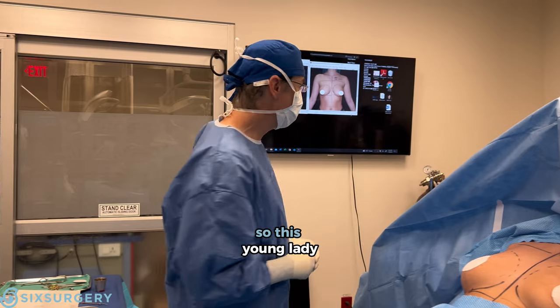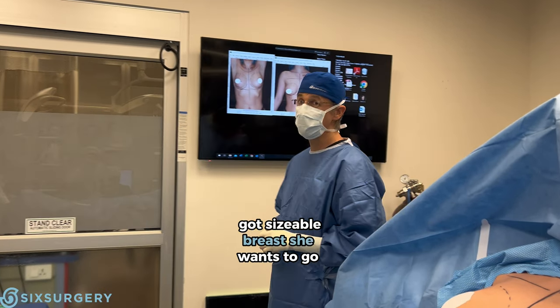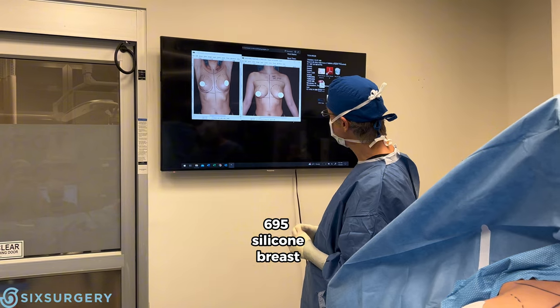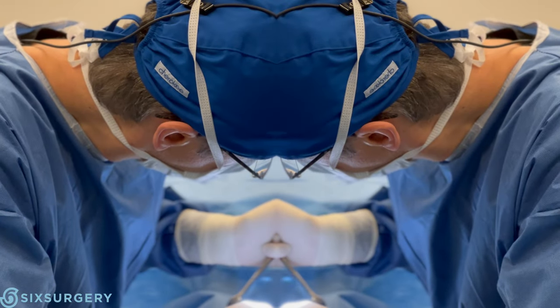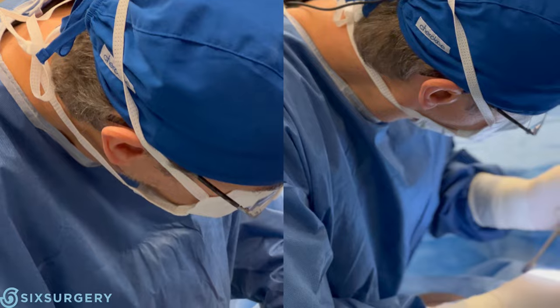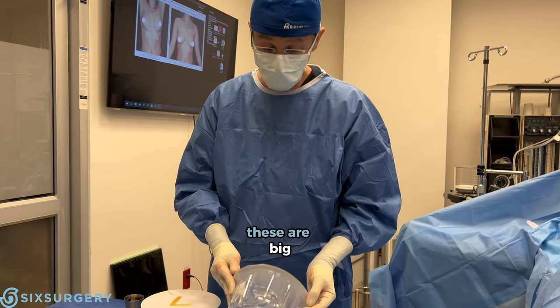Up next, breast augmentation. This is a good sizable breast — she wants to go bigger. We're going to go with a high profile 695 silicone, breast fold, under the muscle. Let's take a look at our implants — these are big, nice and big.